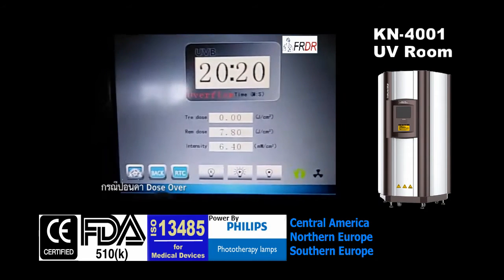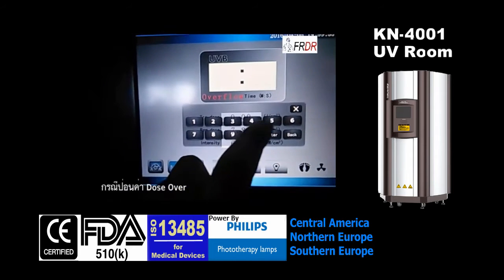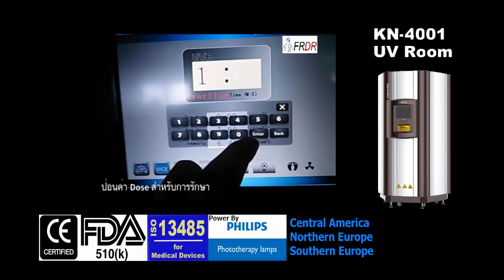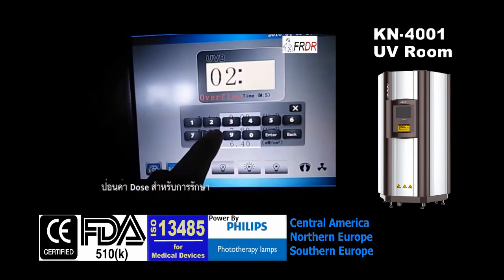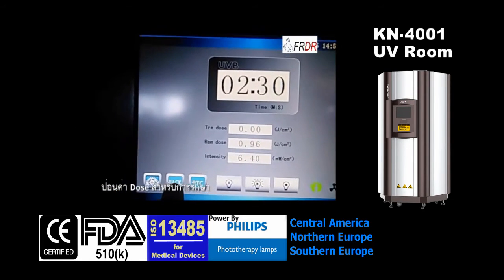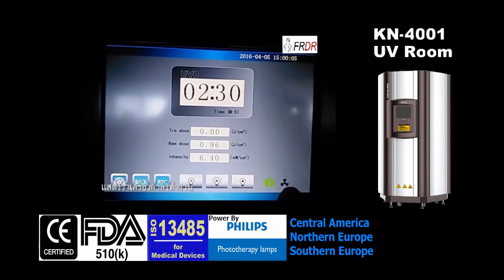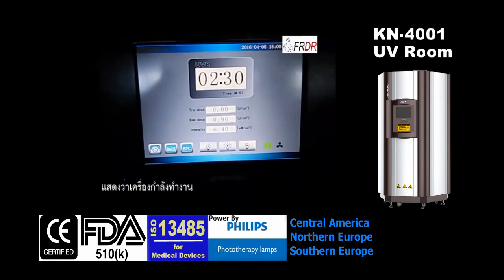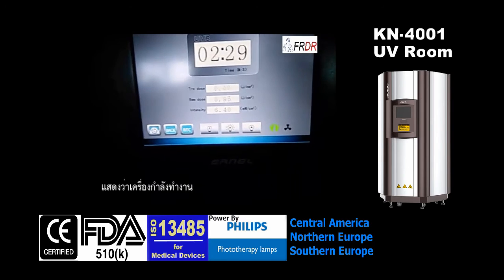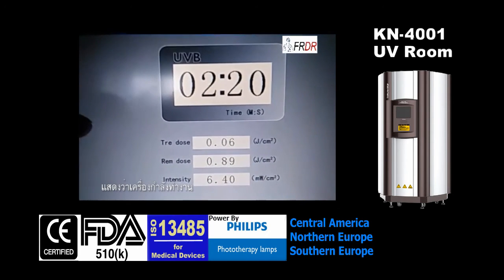The dosage is displayed based on the intensity. This is how to adjust the time — press here to start. This means the fan is on. As you can hear, there is a voice to remind the patients or doctors to wear goggles during the treatment. As you can see, the time is automatically counting down.